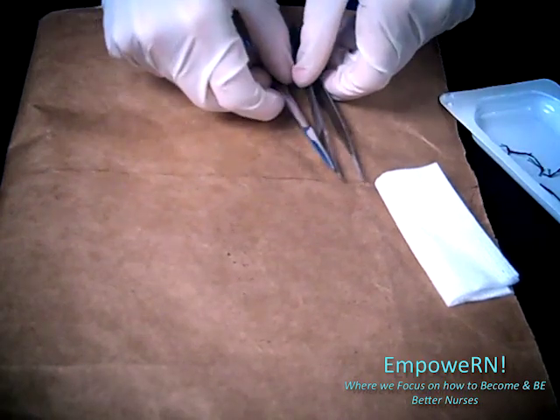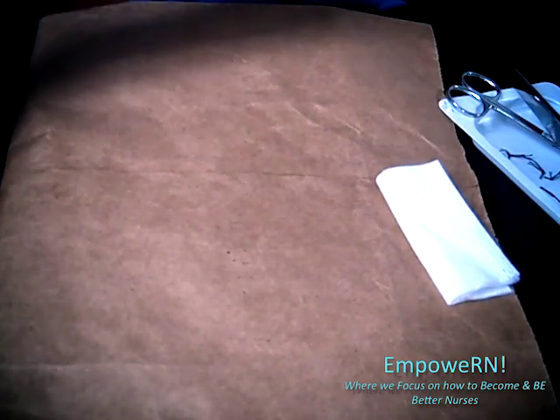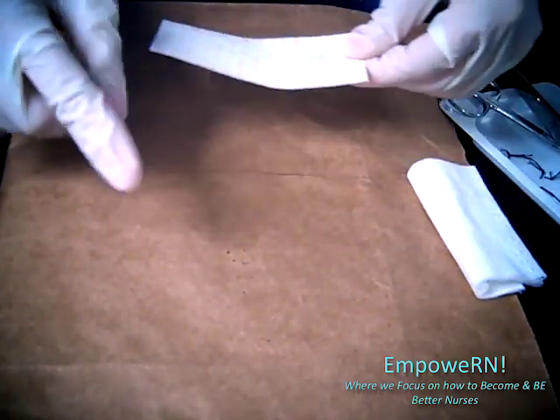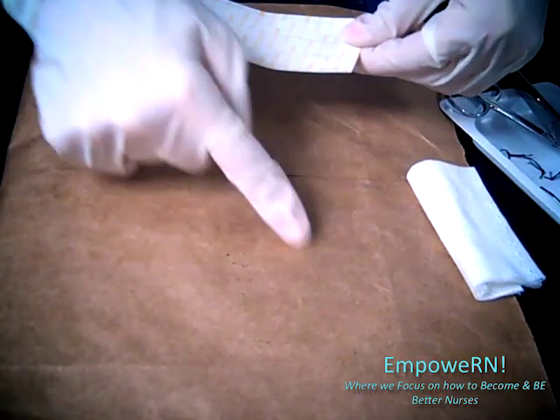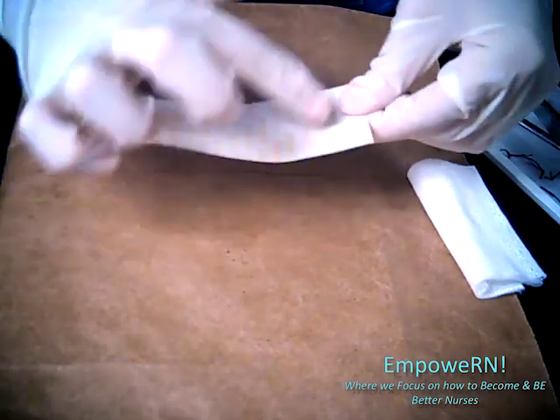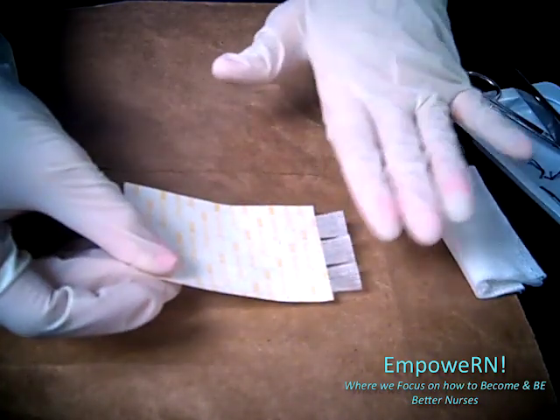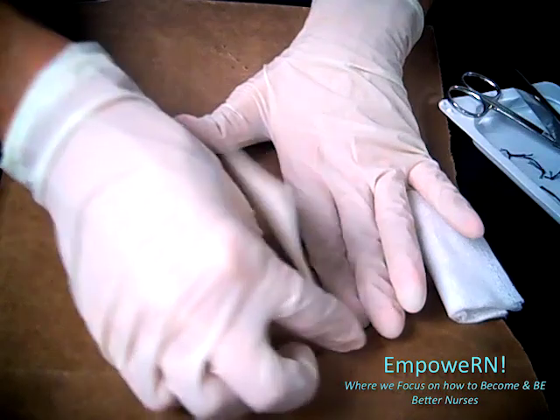After this, whatever the doctor orders — they usually order Steri-Strips. So we get our Steri-Strips. I like to put skin prep around the outside; it looks like an alcohol swab and that just makes the strips stay a little bit better. Then you lift like this, make sure the incision is going to be in the middle, and you go down like this. Perfect.